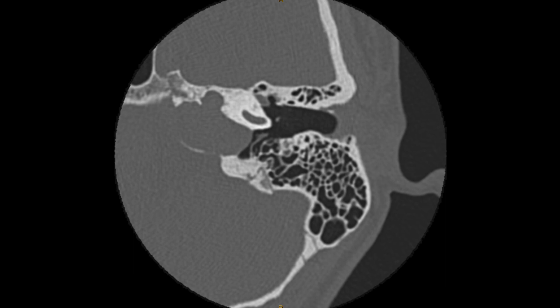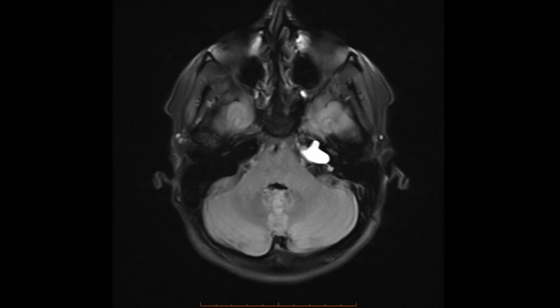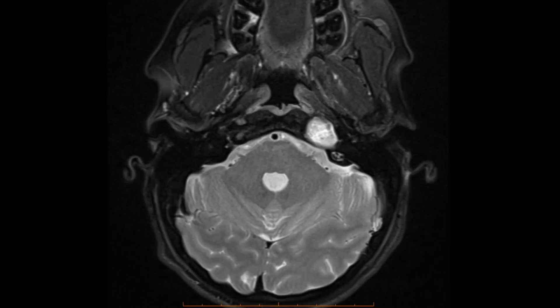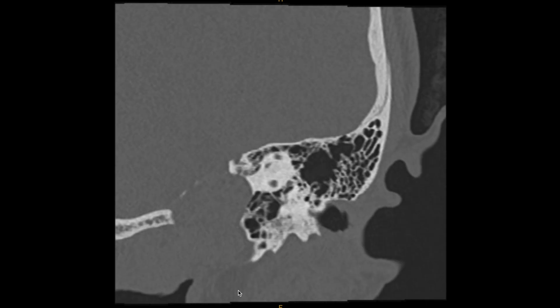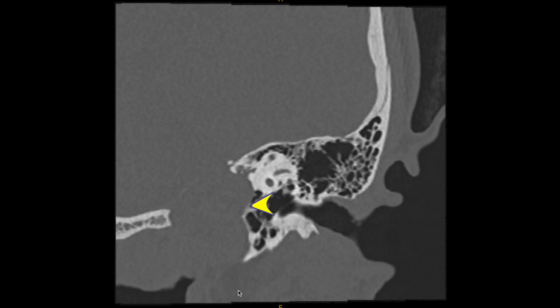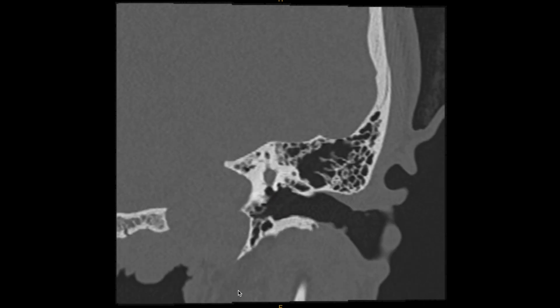On the axial T1-weighted images it was bright on signal and on T2-weighted images bright on signal, consistent with cholesterol granuloma. On this coronal image we can see very clearly a nice infracochlear approach below the cochlea with the carotid artery and jugular bulb out of the way.